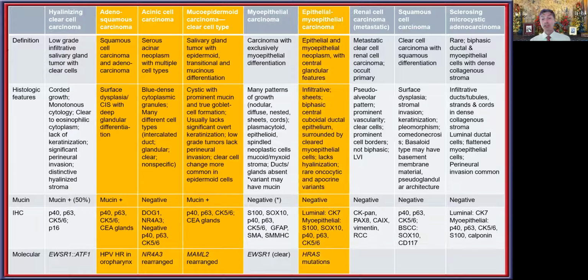When you think now about the costs of the FISH probes, somewhere in the range of $250 to $400, depending on who you use and where you get it from, you can tell that it's more expensive than getting an immuno, but it's not quite the $5,000 of a molecular study that we used to have several years ago. Here is an example of MAML2 as a break apart, just showing you that it is quite helpful in these settings, although of course all of the FISH look identical to one another. You can't really tell which probes are being used just by looking at it here.